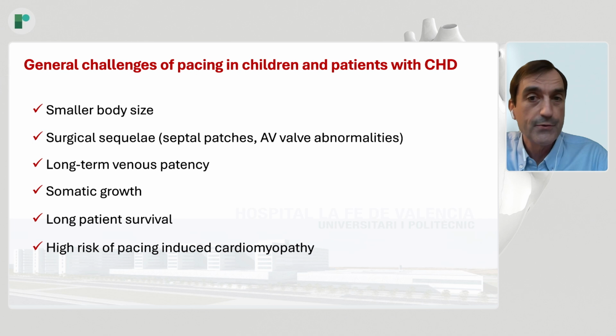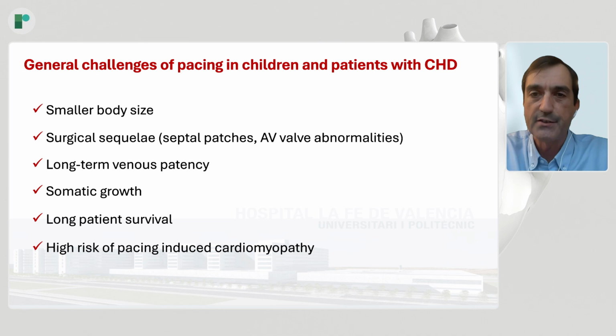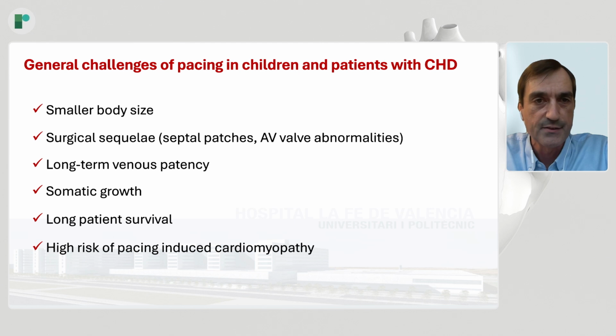The somatic growth of the patients is also an issue, as well as the long patient survival. And an important issue is that these patients are at really high risk of developing pacing-induced cardiomyopathy with conventional right ventricular pacing. So it's really interesting to have the opportunity to use a really physiologic pacing modality for these patients.